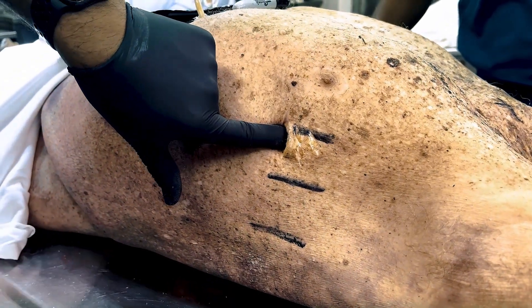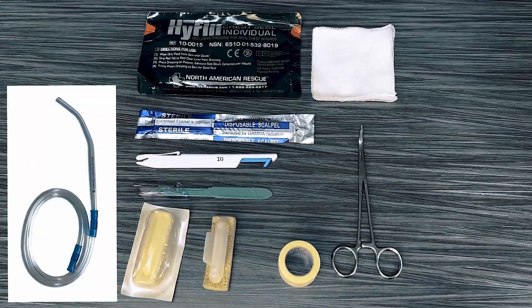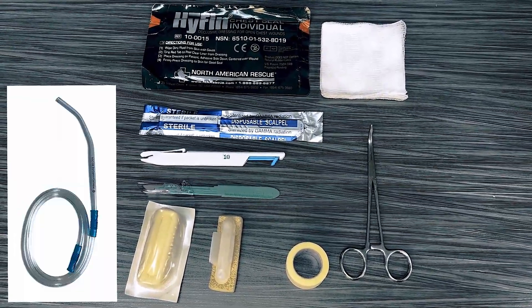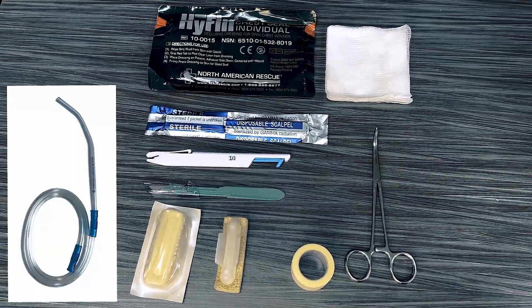Gather the necessary equipment including the number 10 scalpel blade, a 6 and a quarter inch Kelly forceps, large chlorhexidine preps, and the HyFin Vent chest seal.